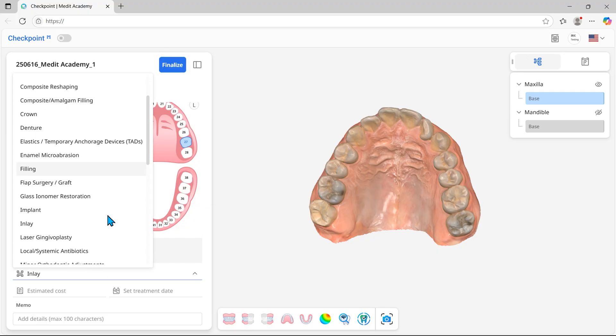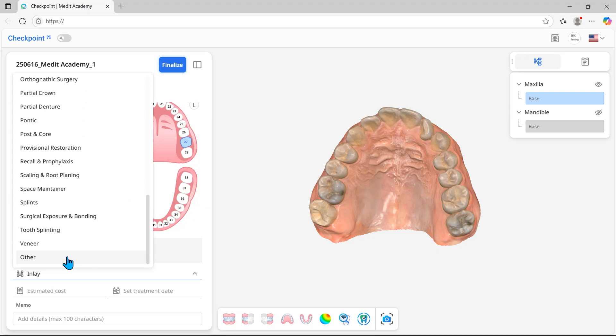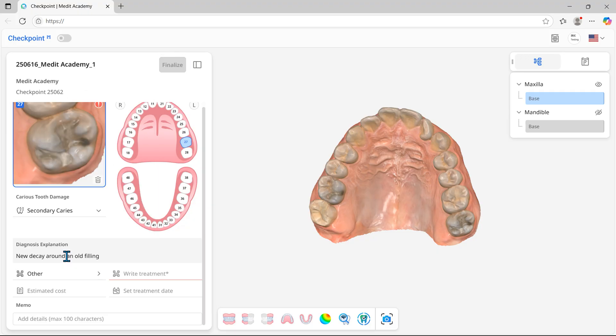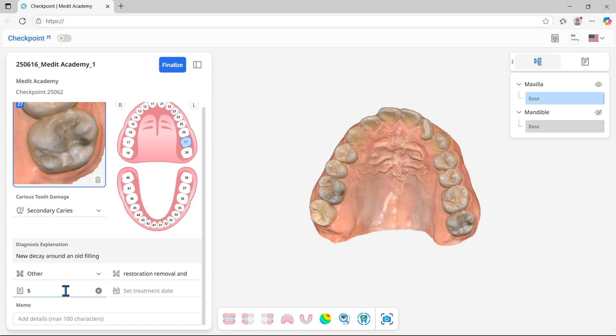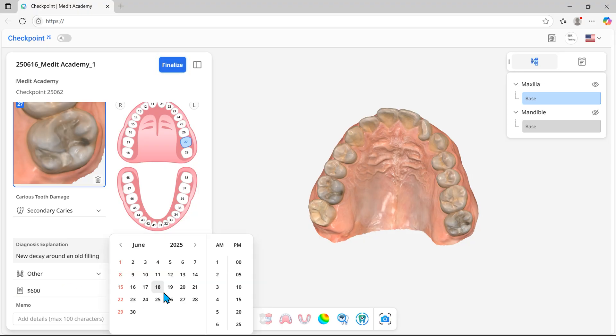Choose the other option to enter a diagnosis or treatment details manually. You can set the estimated cost and treatment date, as well as add a memo.